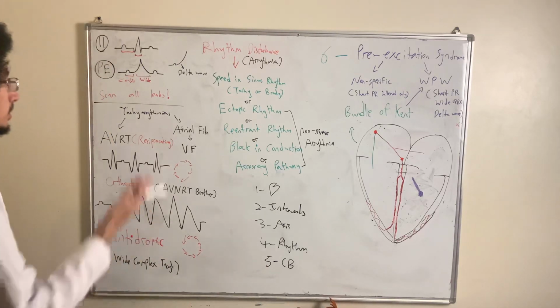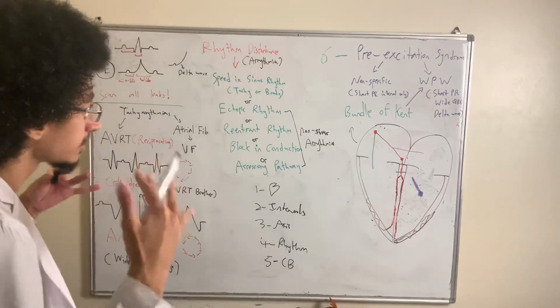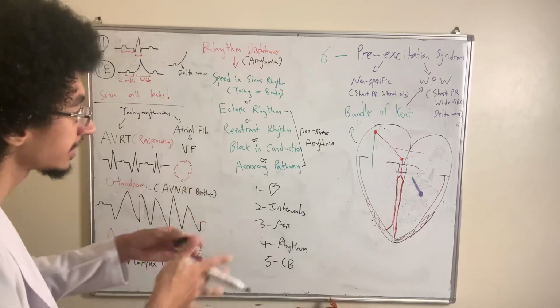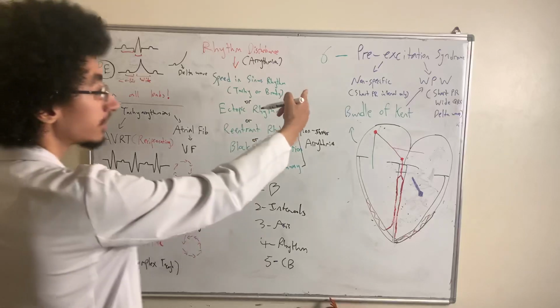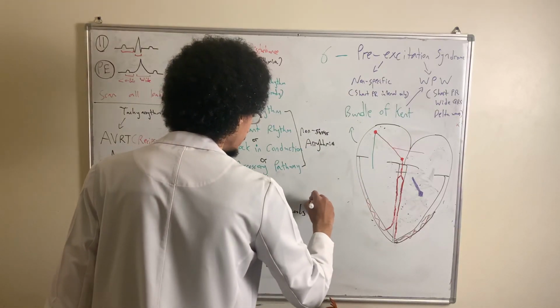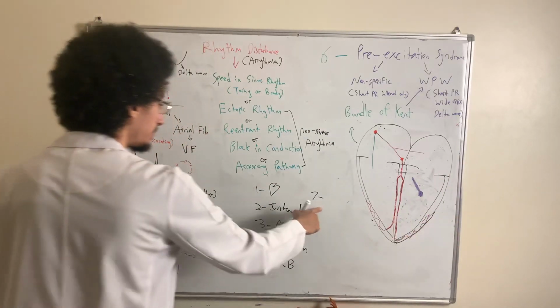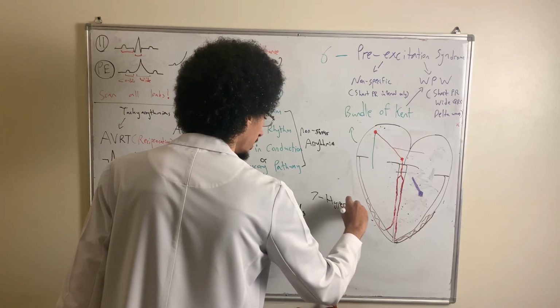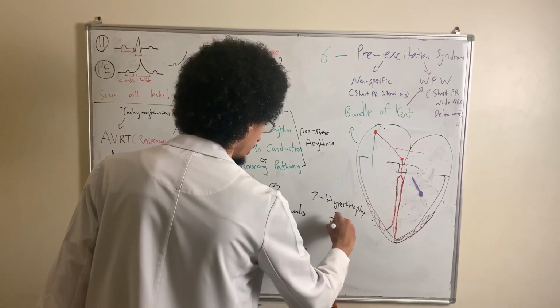Some people commonly use lead 2, but to start with, you can scan all the leads because it's not specific. This syndrome, Wolff-Parkinson-White for instance, is not specific to a specific lead. So we must search in step number 6, pre-excitation syndrome, in all of the leads. And then step number 7, as you know from the previous video, was hypertrophy as well as atrial enlargement.